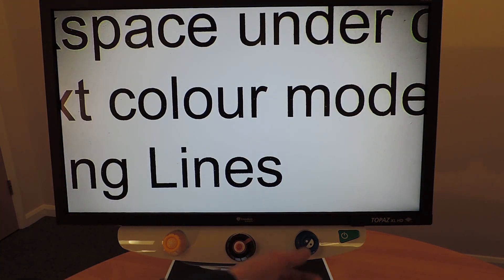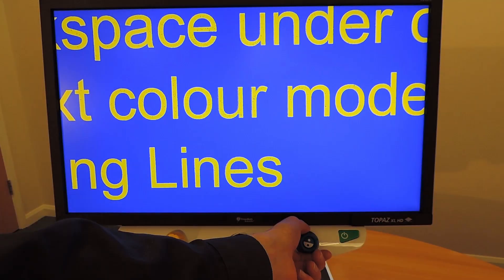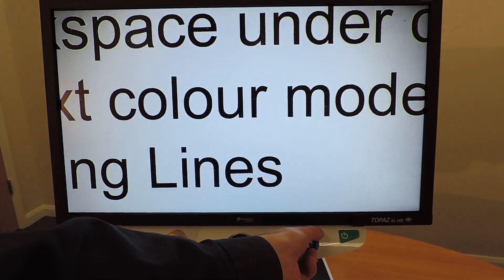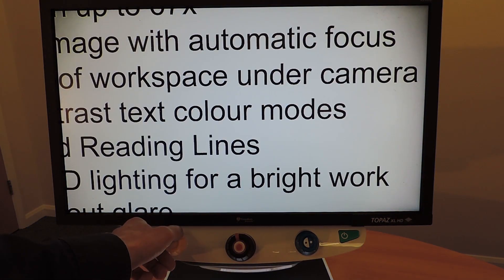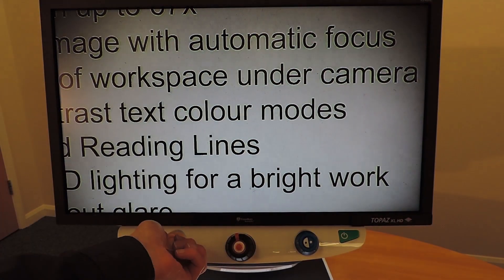Use the blue colour mode dial to cycle through up to 27 customisable high contrast colour modes. Use the yellow brightness dial on the left side to control the brightness levels to aid with different backgrounds and lighting conditions.